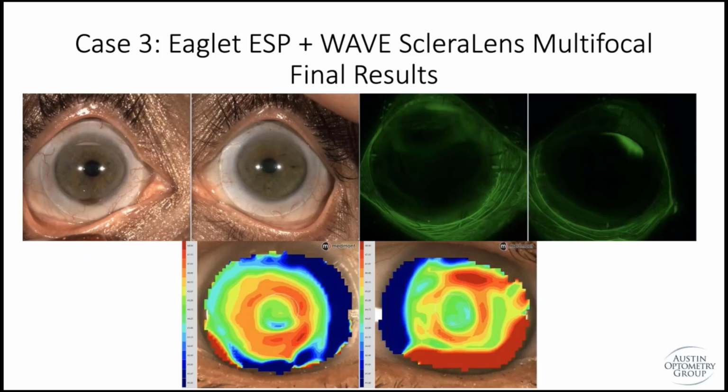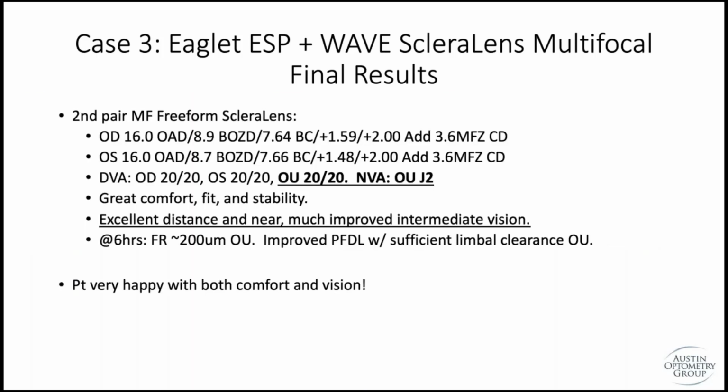Again, beautiful fit. As far as rotation, it still may or may not rotate some. These seem to be looking really good at this moment, and you can see the optics look great with the topography over the lens. The patient was very, very happy. 20/20 everywhere. Intermediate vision much improved. Fit looking perfect.